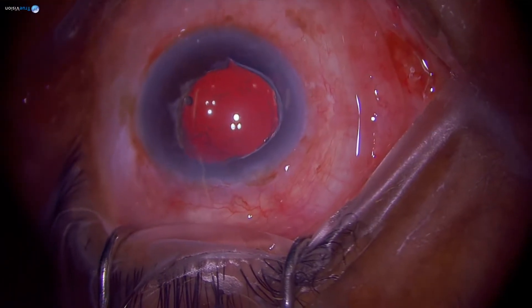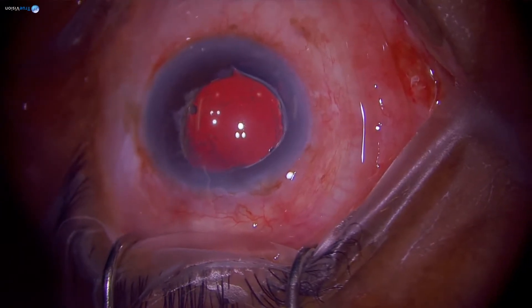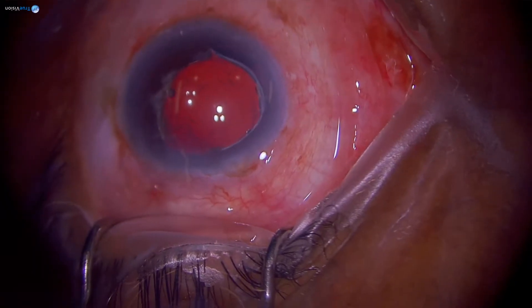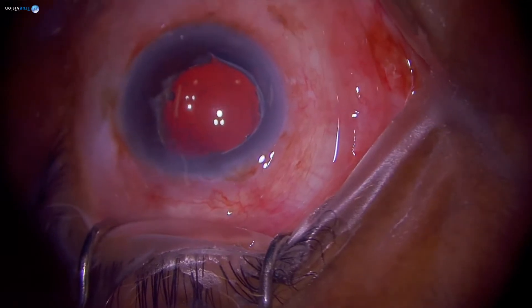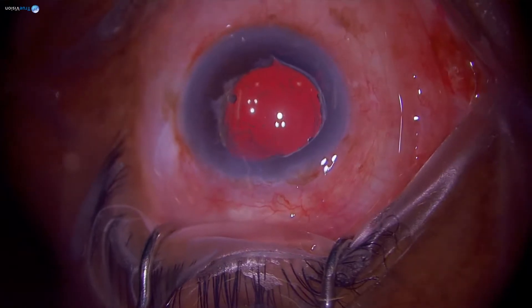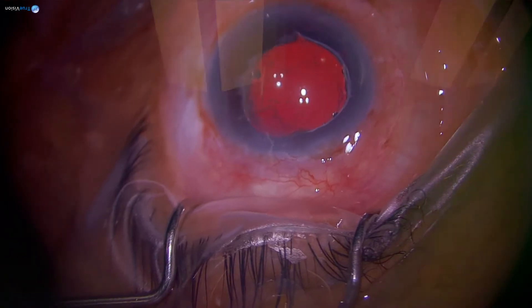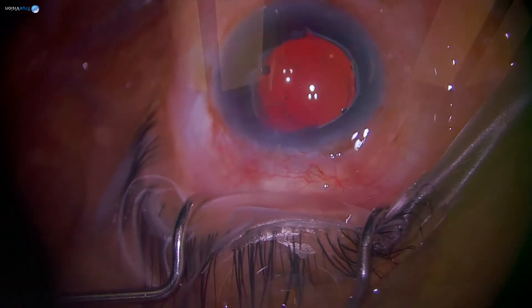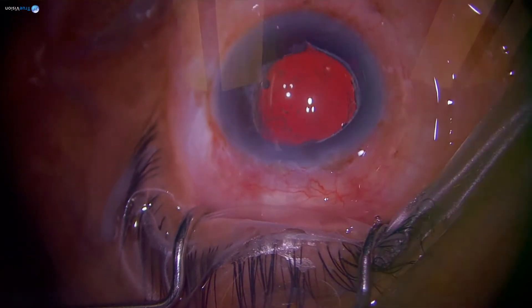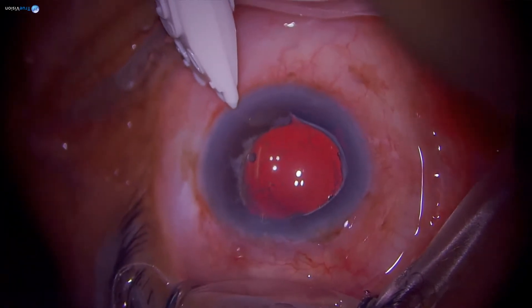This patient has diabetic retinopathy. The other eye had a traction with a membrane but was stable. This eye has a subhyaloid hemorrhage on the macula with diabetic retinopathy changes. The plan is to remove the vitreous, approach the subhyaloid hemorrhage, clear the blood, and then perform a 360-degree laser PRP to regress the retinopathy. We'll see if anything else is required during surgery.